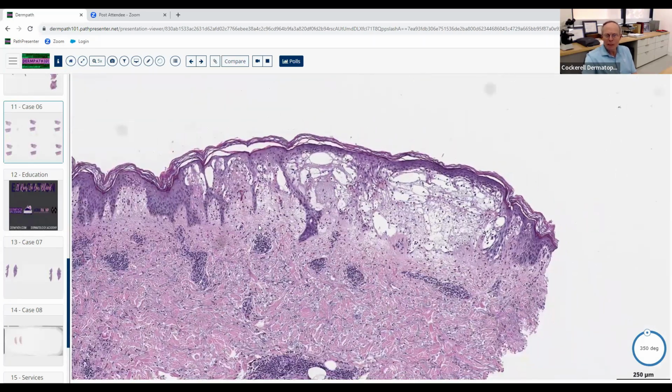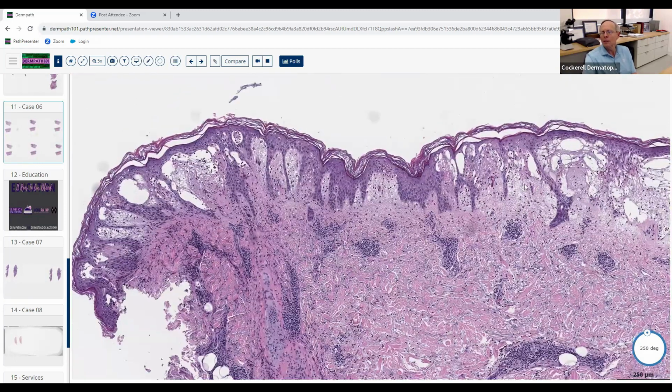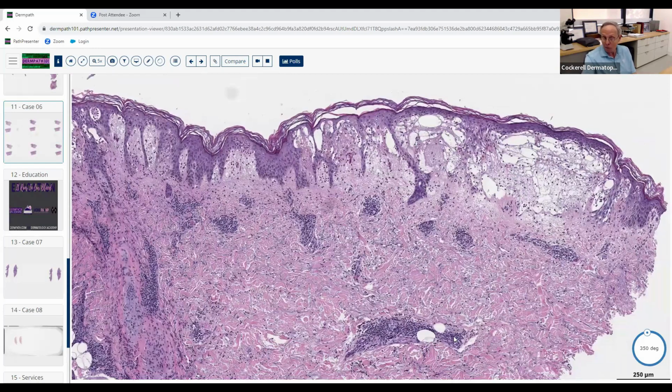In bullous pemphigoid, theoretically, this could be bullous pemphigoid. I wouldn't say it couldn't. The other couple of things I'd throw into the differential diagnosis would be a bullous arthropod assault reaction, which could look like this too. There is a dermal involvement here. Pemphigoid usually gives you a band-like infiltrate of lymphocytes and eos, and rarely neutrophils. You sometimes get neutrophils in bullous pemphigoid, but it's relatively rare. And if you get an early lesion, like an urticarial lesion, you'll see a band-like infiltrate, usually not sufficiently deep like this, more of a band-like infiltrate with lymphs and eos.